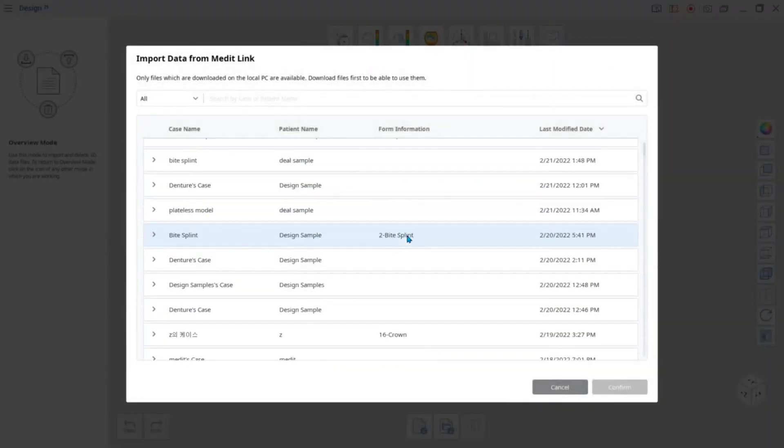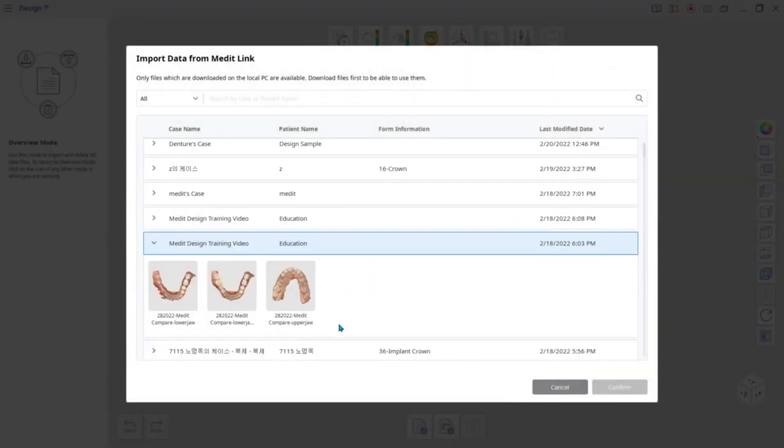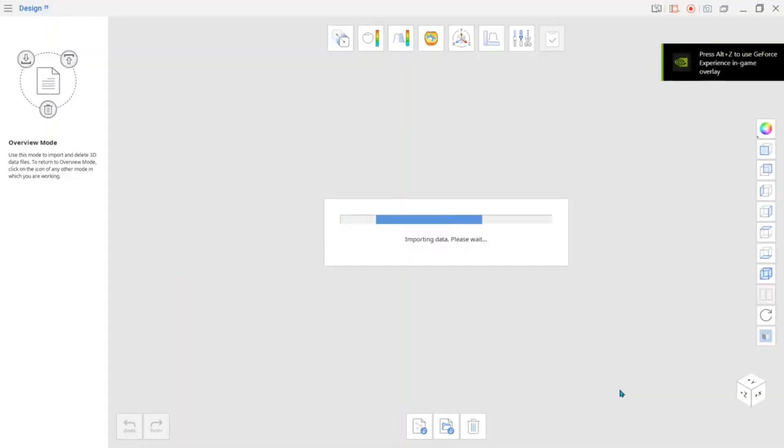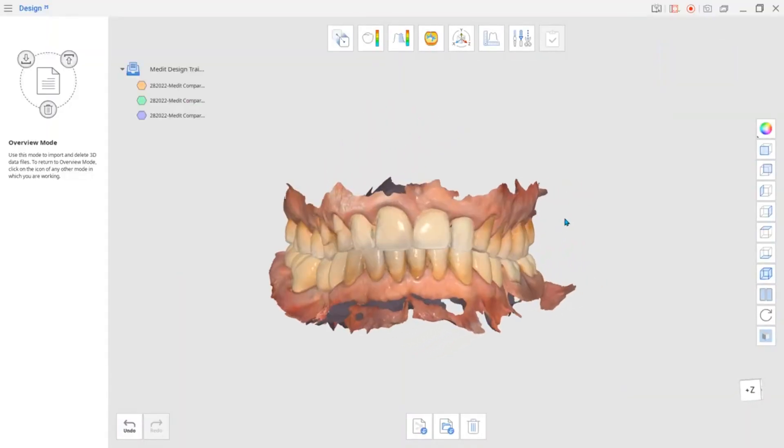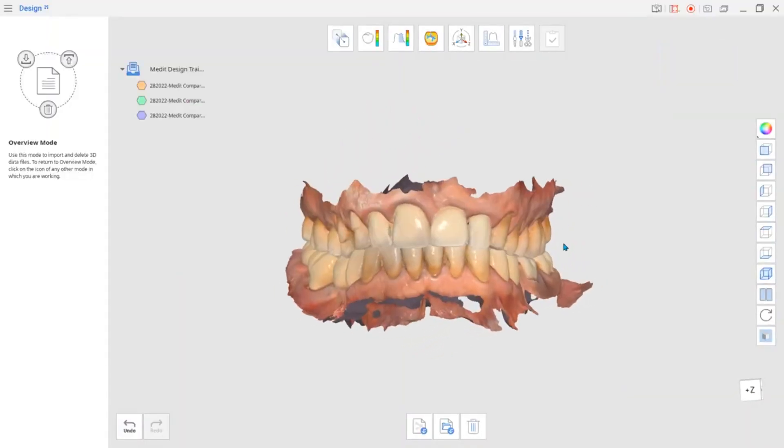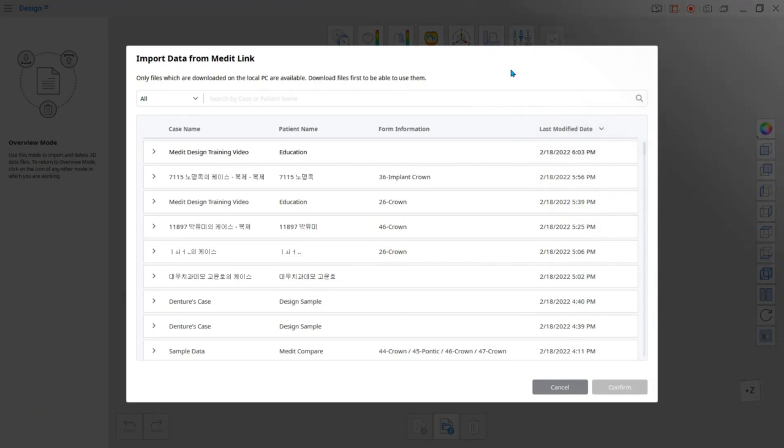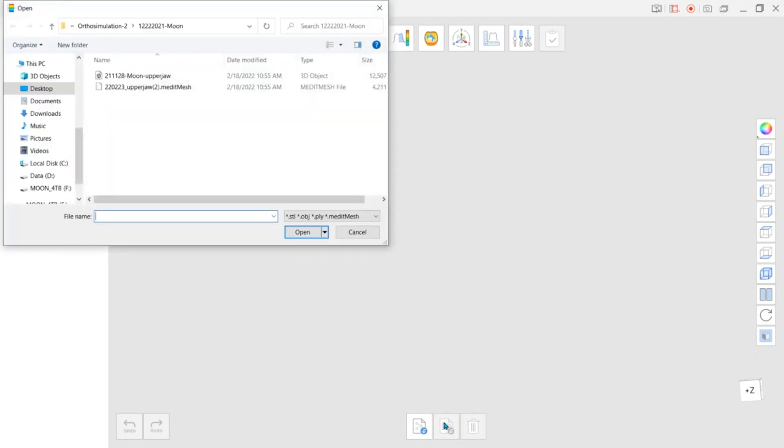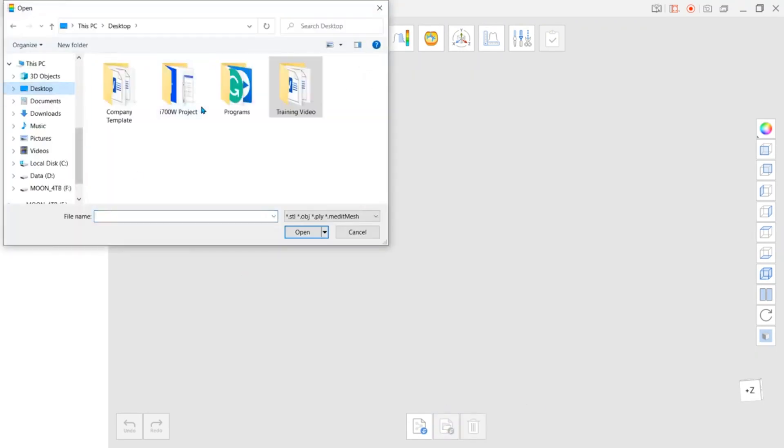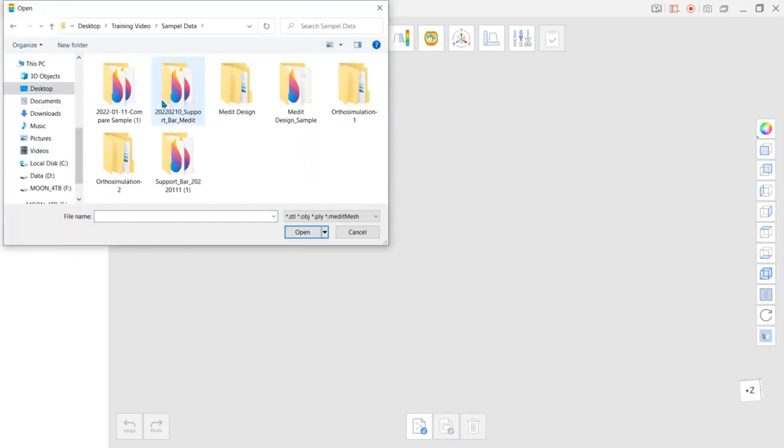In the new dialog window, you will be asked to import scan data for Medit Link. You can also import data saved outside of Medit Link. To do this, first click Cancel and then find the Import Local Files icon at the bottom of the app window.